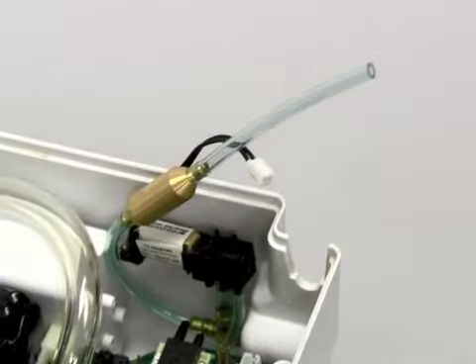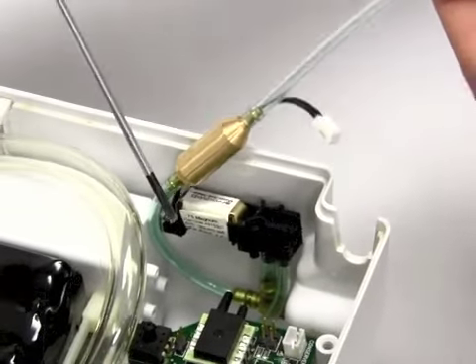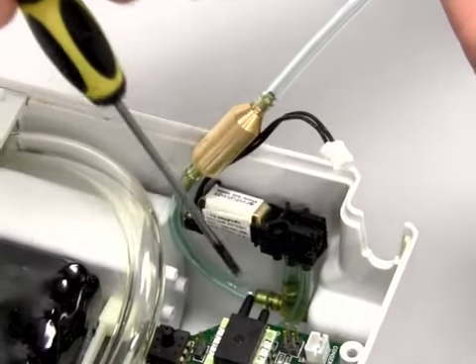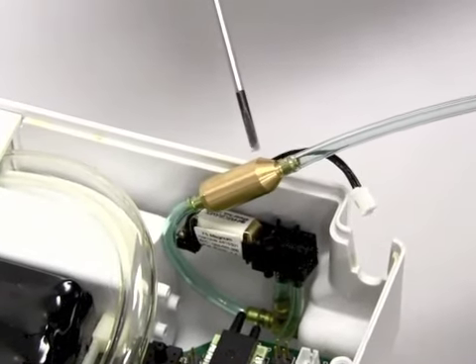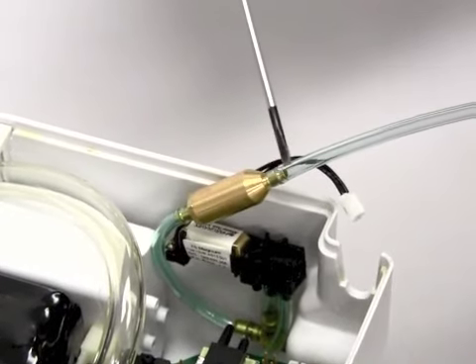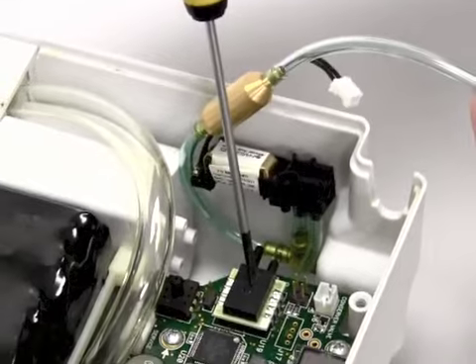This now shows that I have attached the isolation valve to the Tygon tubing off of the port on the cannula, and now I have put Tygon tubing going from the cone. And again, this is important to see that the isolation valve with the cone shape on the end is the part that attaches to the pressure sensor.